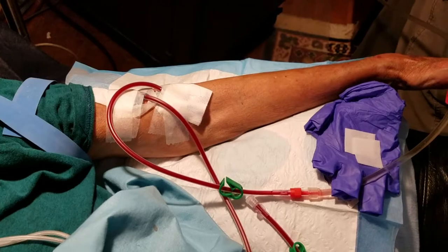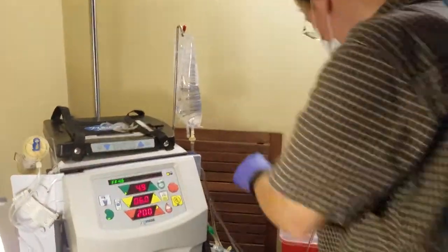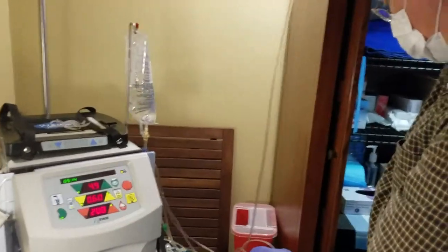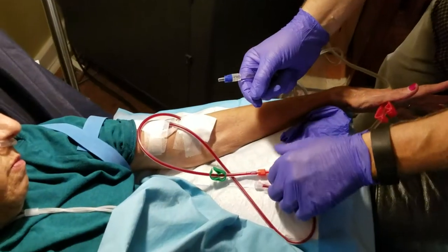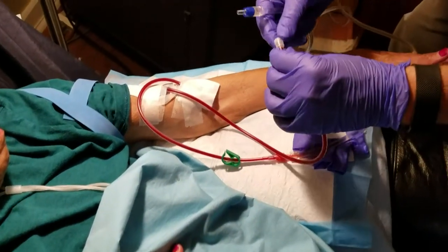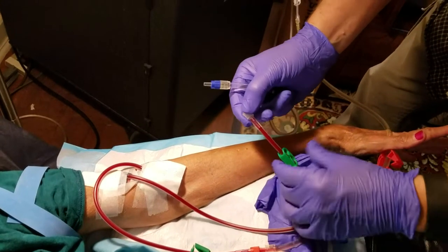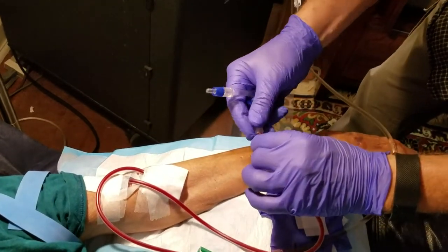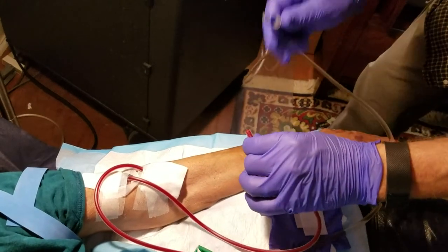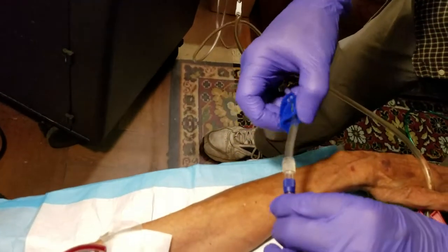It's sucking it from Sheila. And I didn't have to untangle anything too much there. Always double check to see it's clamped, because if it's not clamped you're gonna have a spray of blood. And I did that once, and once was all I want. That's enough.